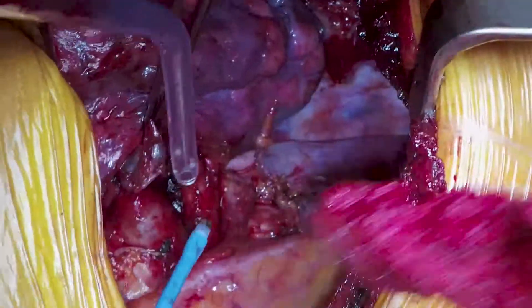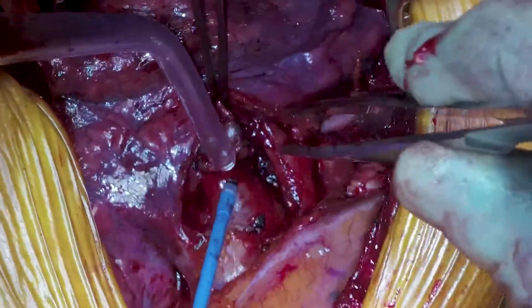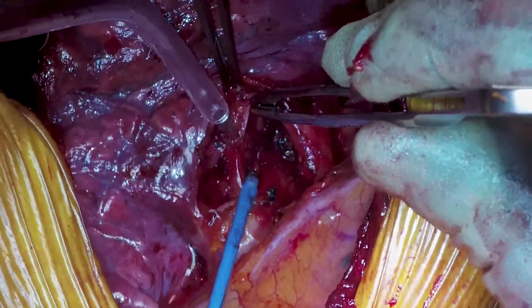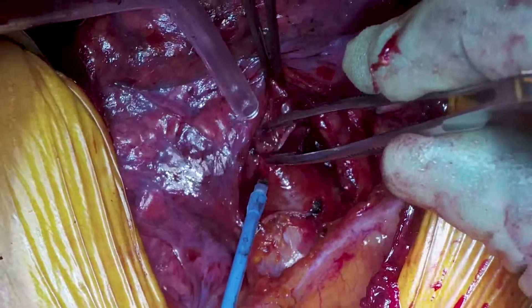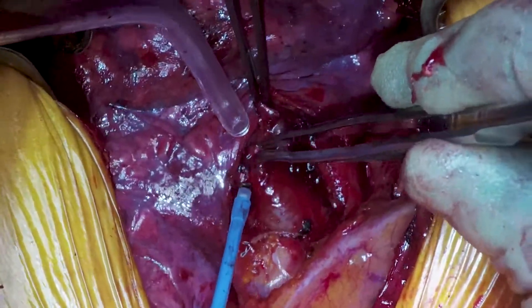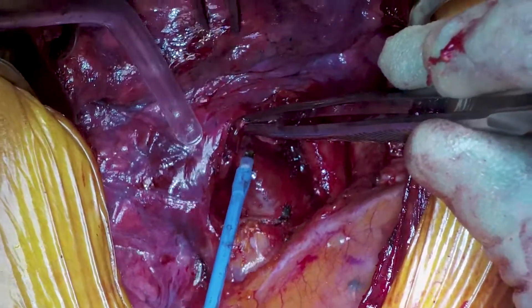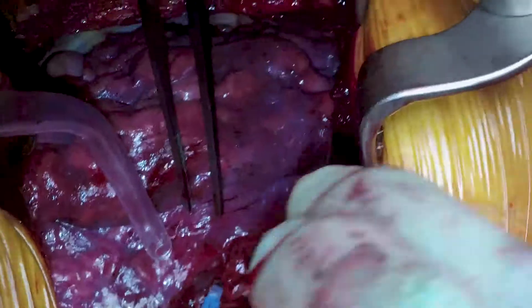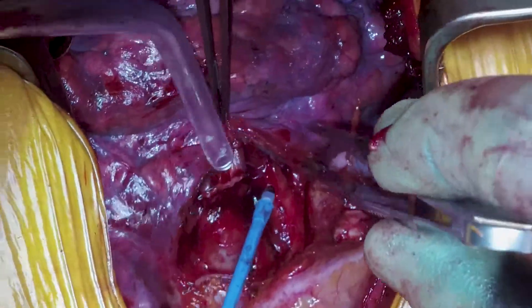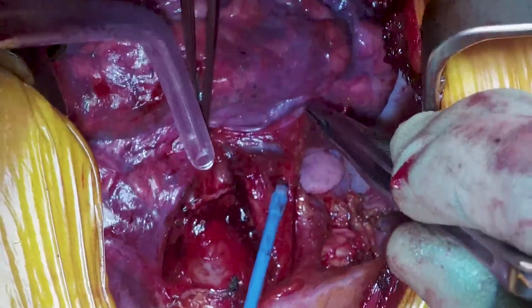This gives a really nice view into the vessel anatomy of the thorax. Mr. Dunning is pointing to the main pulmonary artery, and above that, held with the forceps, you can see the stump of the right upper lobe vein which he's dissecting away. Often you'll find posterior to this an ascending second branch which you need to watch out for in case it bleeds. To the right you can see the truncal branch of the pulmonary artery, otherwise known as the S1-S3 branch.